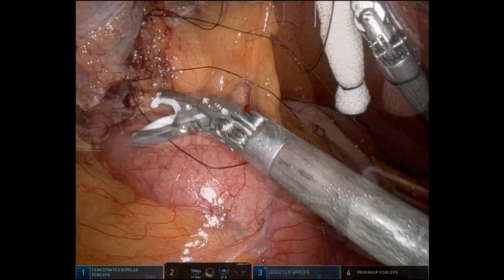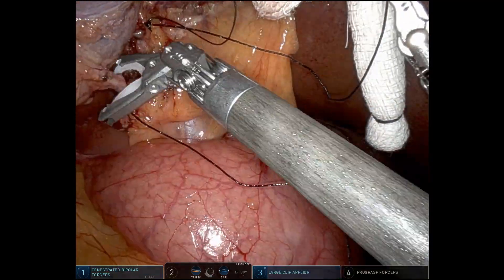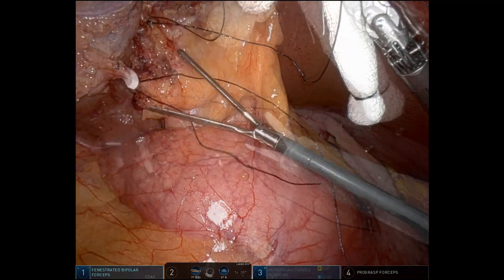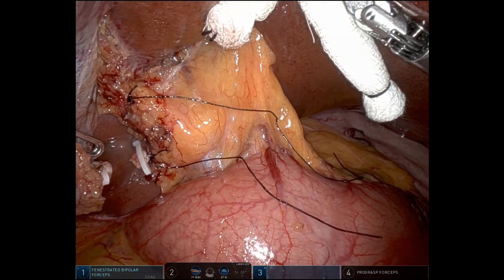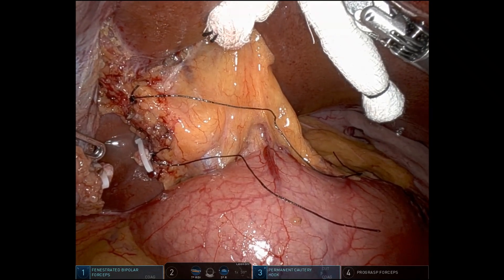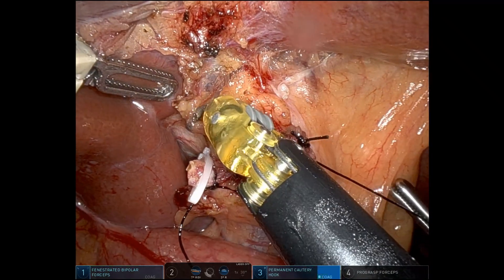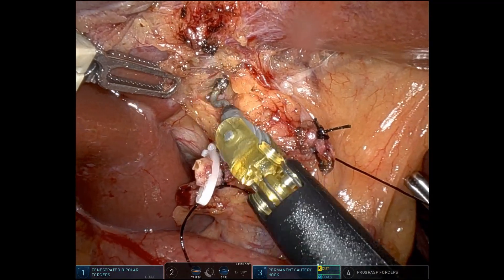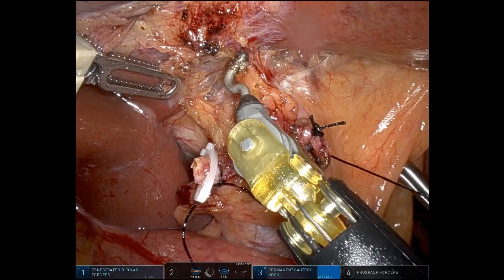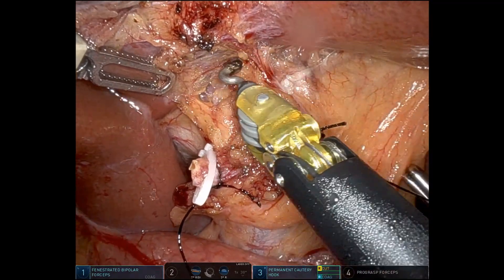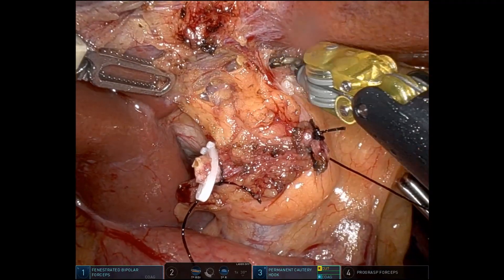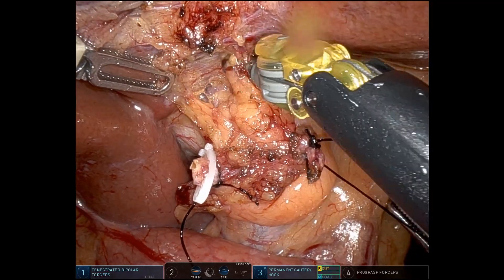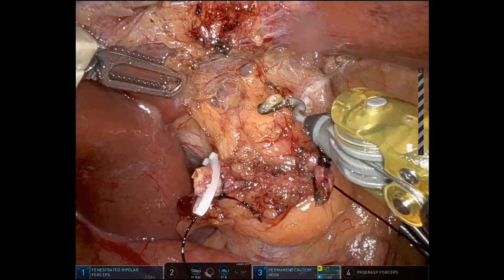This is the cystic duct. We place a silk tie and then also a weck clip. We place the silk tie so that those sutures can then be grasped by the assistant and retracted to the patient's left to aid exposure to the hilum and to the portal vein pedicles, which are positioned posteriorly and on the right lateral aspect.